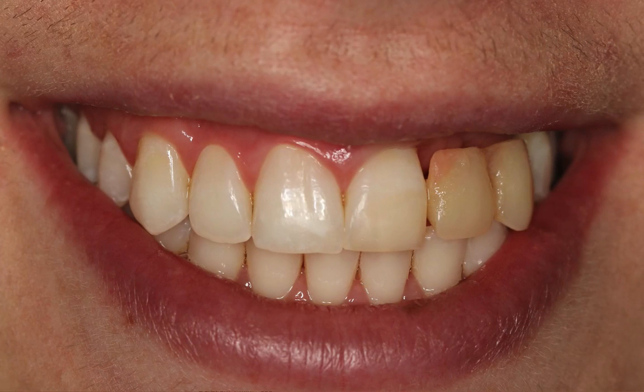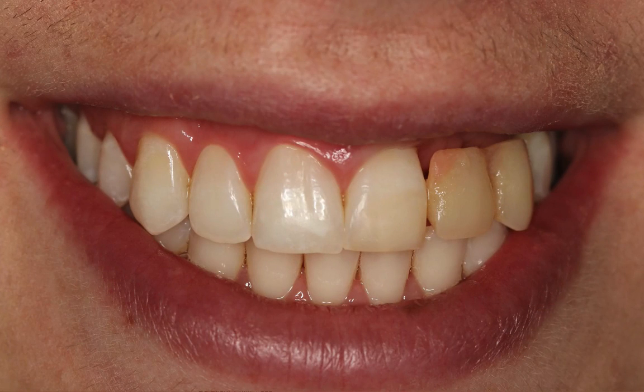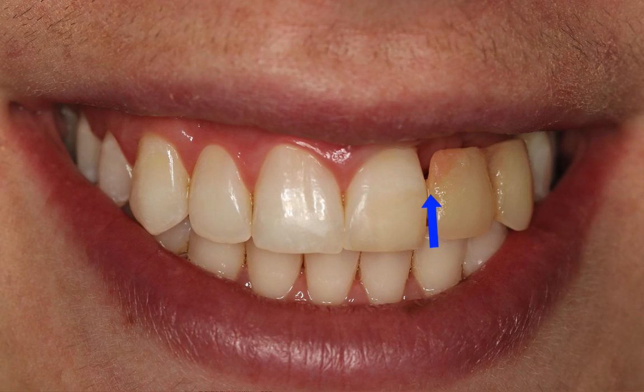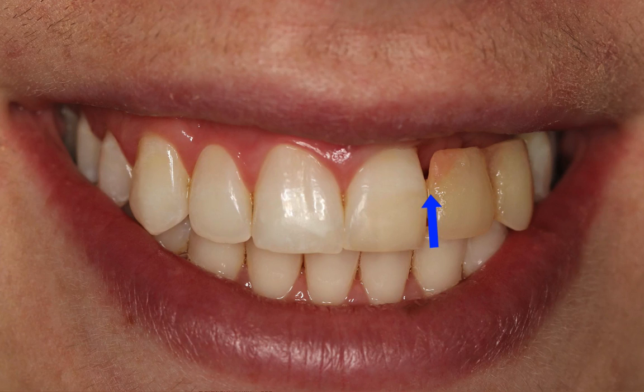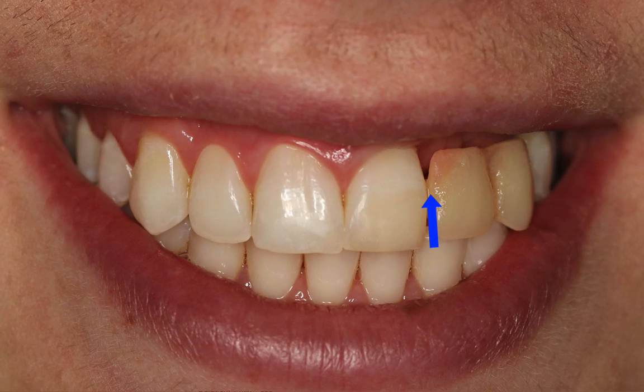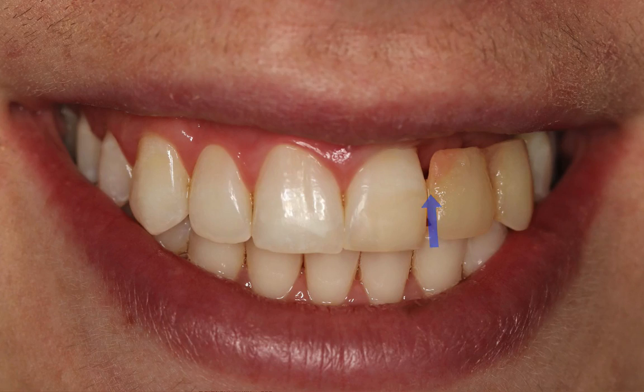We can eliminate some of the gingival display, which is all positive. But we also have to see what are the limitations of this case. We still have excessive tissue. We still have a deficient ridge. And the most challenging is really the transition between the final implant restoration and the left central incisor, because there's no papilla. So it'll be very interesting to see how this case will resolve.